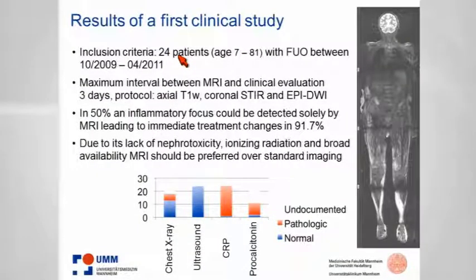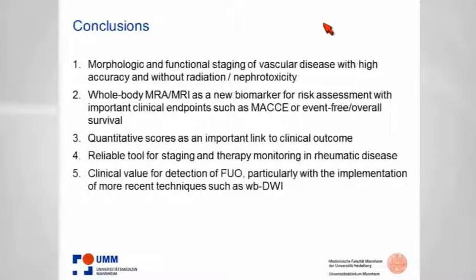Now, we did that study in 24 patients, compared this to the standard protocol workup, and amazingly, 50% of inflammatory foci could be detected solely by MR, leading to an immediate treatment change in over 90% of the cases. And of course, this comes in a very radiation-free environment, which I think is particularly in young patients extremely helpful.